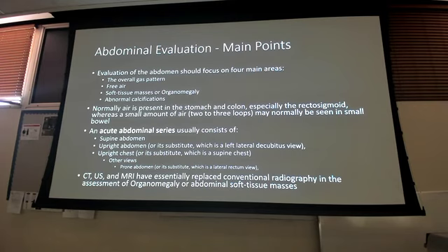So yeah, supine abdomen is going to show you your natural bowel gas pattern. The upright is going to show you air fluid levels if there are any, because again, gravity is going to drop the fluid down and let the air rise up. And we're going to look at all those x-rays. But those are typically the three pictures you're going to get. You may get 3 of them on the exam.